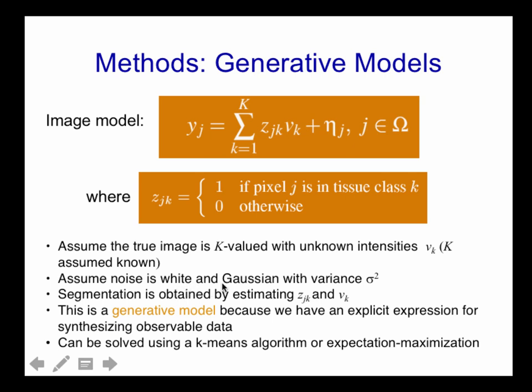but this is where the term generative comes from: if we're assuming that your underlying image is being generated from this sort of statistical process where you have an explicit representation of what is happening, we can call it generative. And what is the importance of being generative?